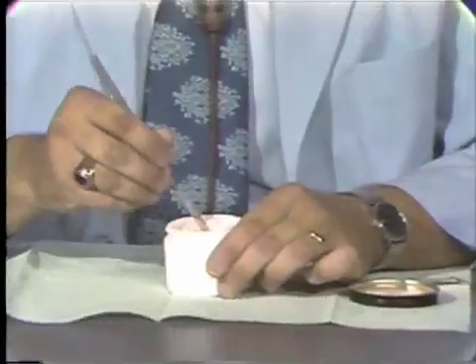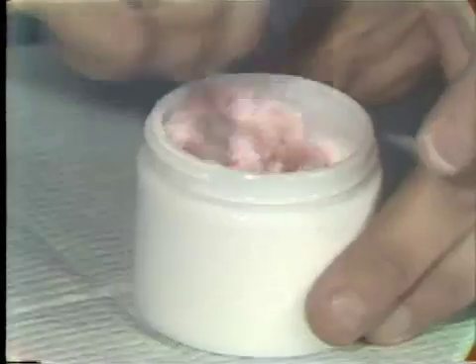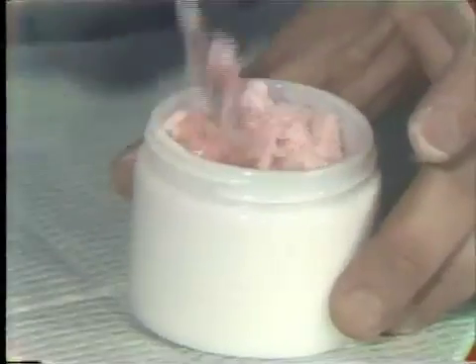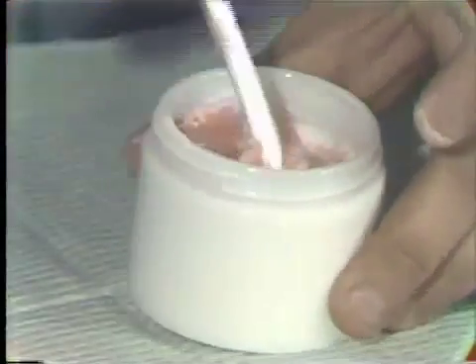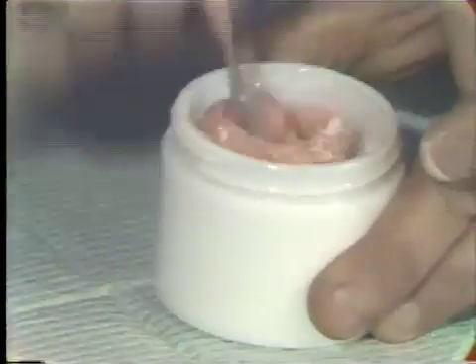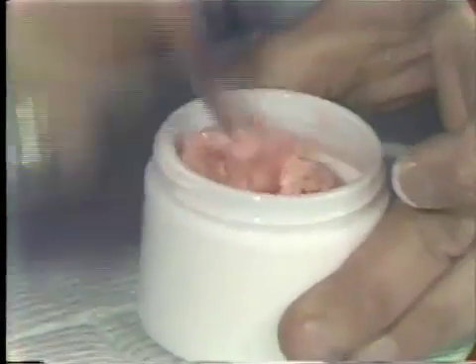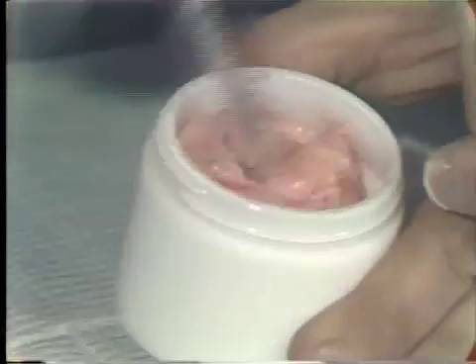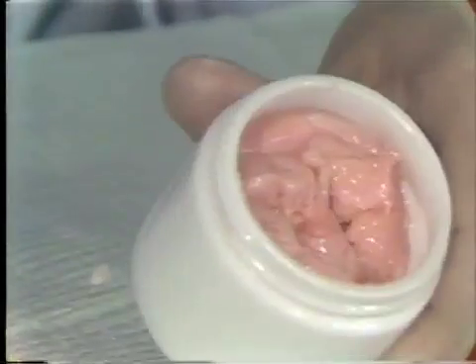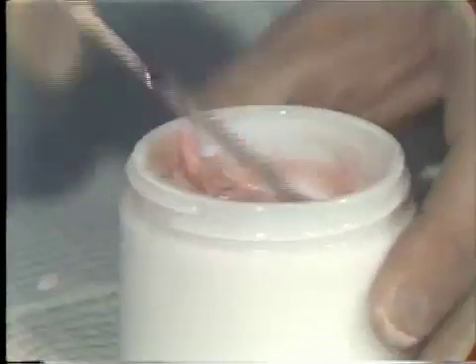When you've added the powder to the liquid, just slowly spatulate back and forth. It will take a minute or two for the particles to be wetted by the monomer. Once you feel that the polymer is adequately wetted by the monomer, as you see here, we can place the top on the mixing jar and let this sit for upwards of 45 minutes.